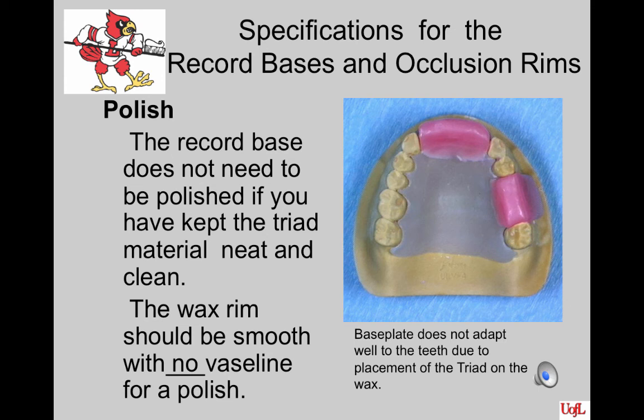The record base of triad does not need to be polished if you have kept the triad material neat and clean. If you adjusted the area significantly, you may want to polish it. The EZ-Tray does not need to be polished — when you work the material while it's heated, you should be able to get a nice smooth surface by wetting your finger and polishing it. The wax rim should be smooth. If you want to polish your wax, place the rim under cold water and use a 2x2 wet gauze to polish or shine it.